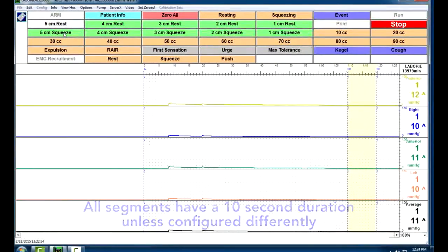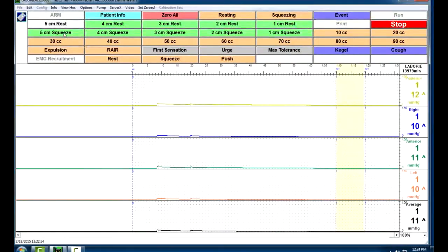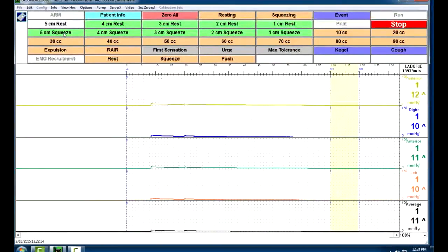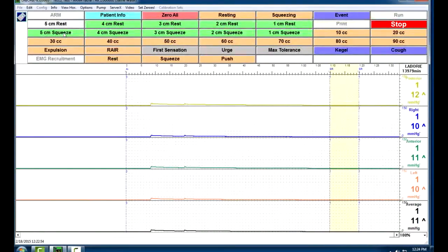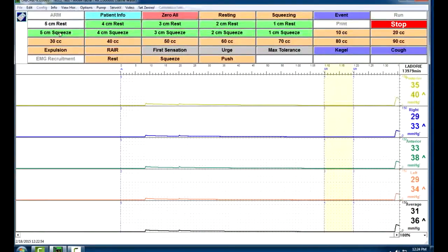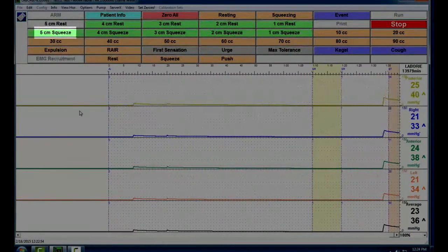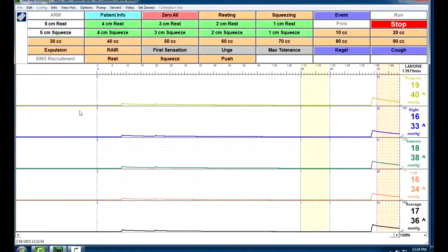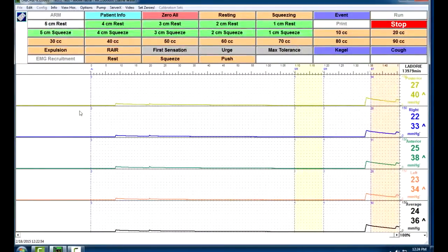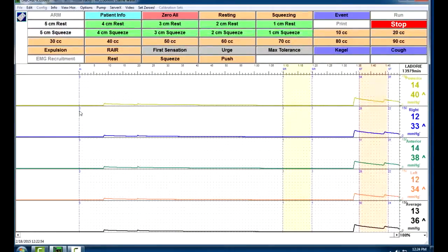We want them to give us as hard a squeeze as they can using just the muscles of their anus. It's like if they were trying to prevent gas from leaking out or trying to prevent a bowel movement. So just go ahead and have them squeeze. You're going to coach them. Say, squeeze, squeeze, squeeze. Keep going. That's it. Keep squeezing as hard as you can. Good, that's real good. Hold it, hold it, and relax.